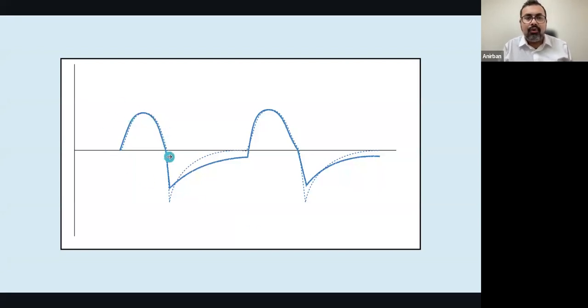What happens if your flow waveform does not reach baseline before the next breath is initiated? So this happens when your expiratory flow has not reached zero before the next breath is started. So this leads to a phenomenon called air trapping. So what is air trapping? The amount of air you have inspired, you are not being able to expire before starting the next inspiration.